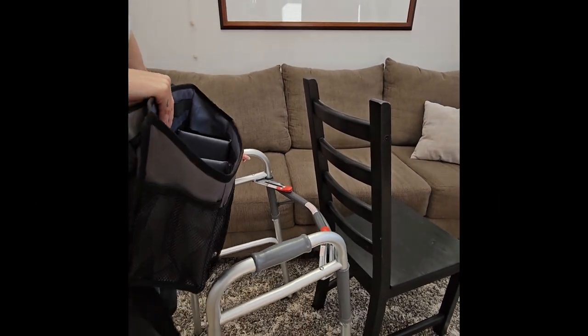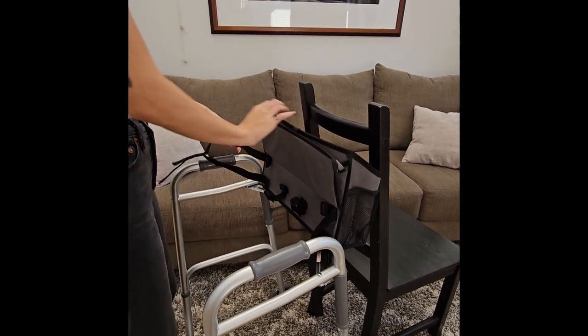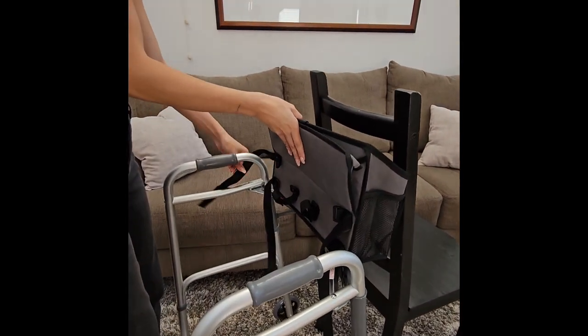To begin installation onto your walker, use the back of a chair or a wall to help balance the bag on the top rail of your walker.